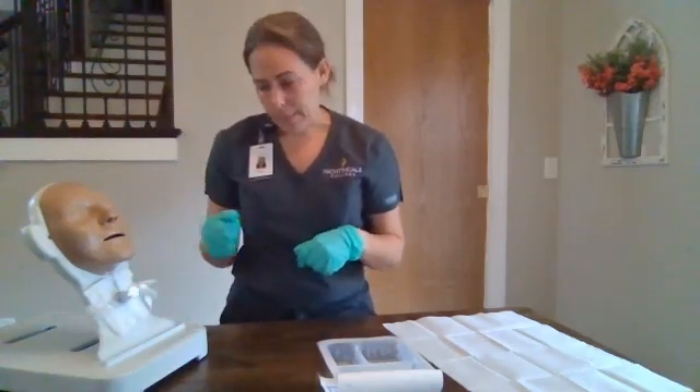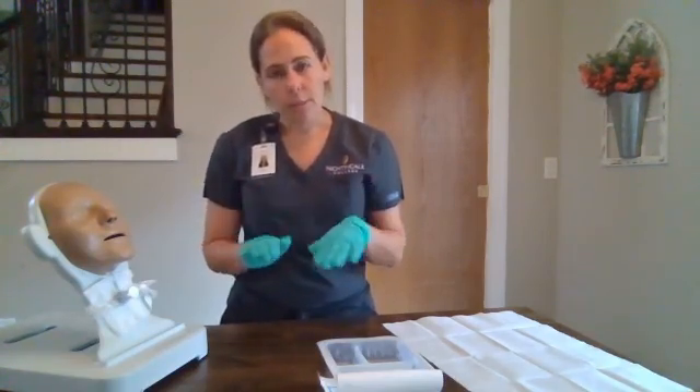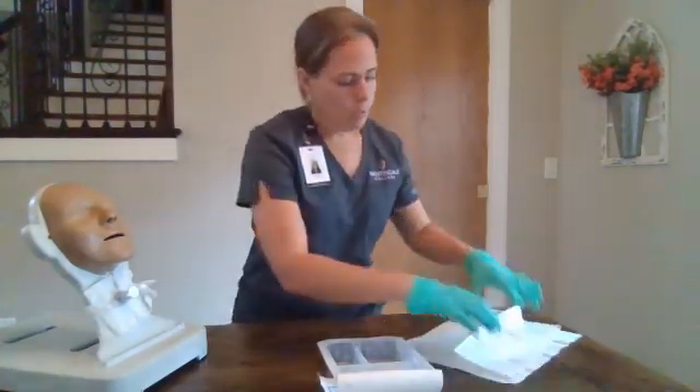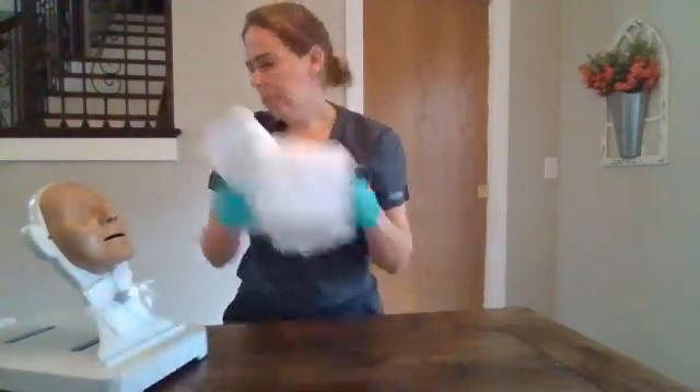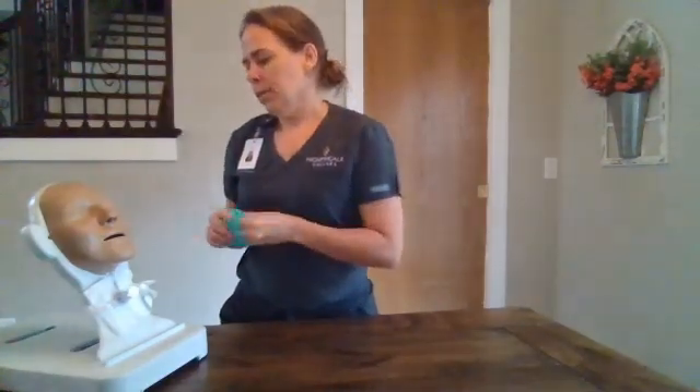We will replace our patient's oxygen, place him in a position of comfort, ensure the bed is low and locked, and his call light is within reach. We're going to discard our supplies and our gloves, perform our hand hygiene, and document our procedure.